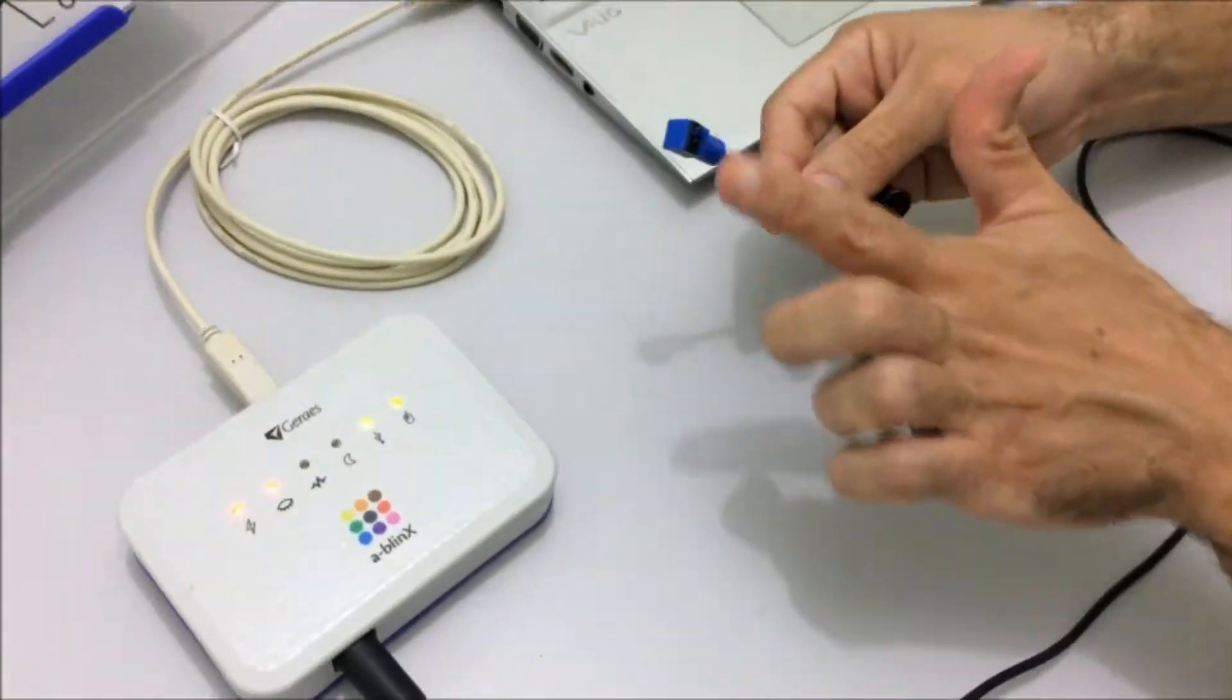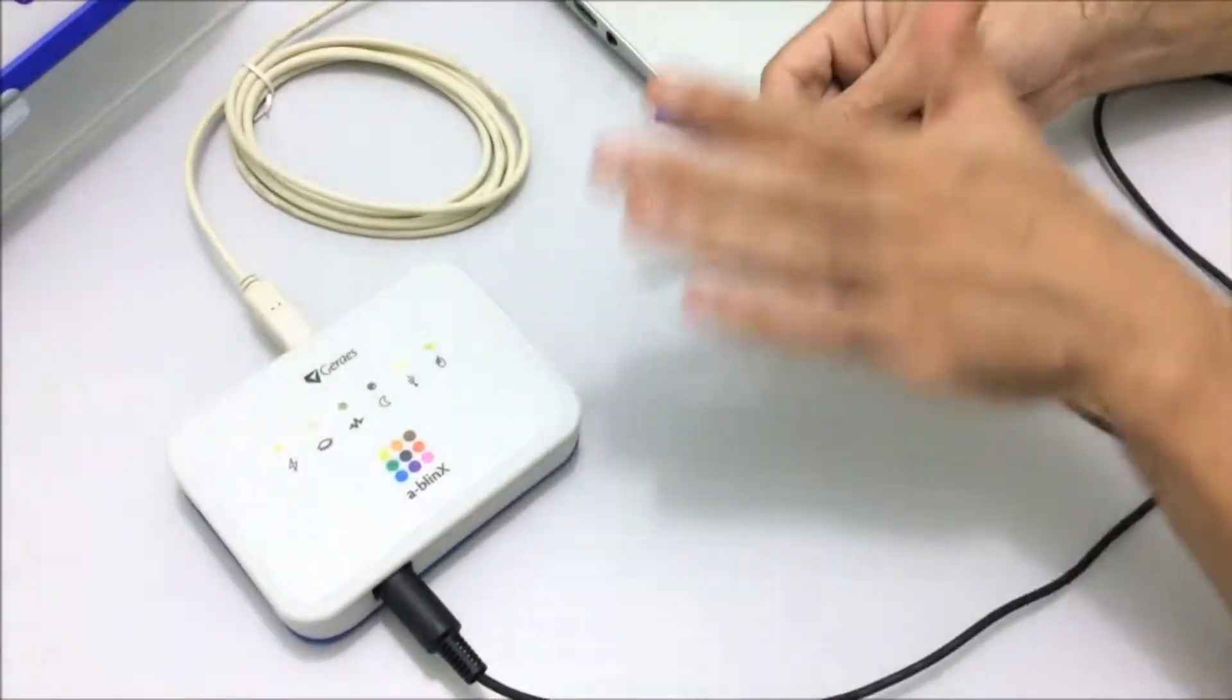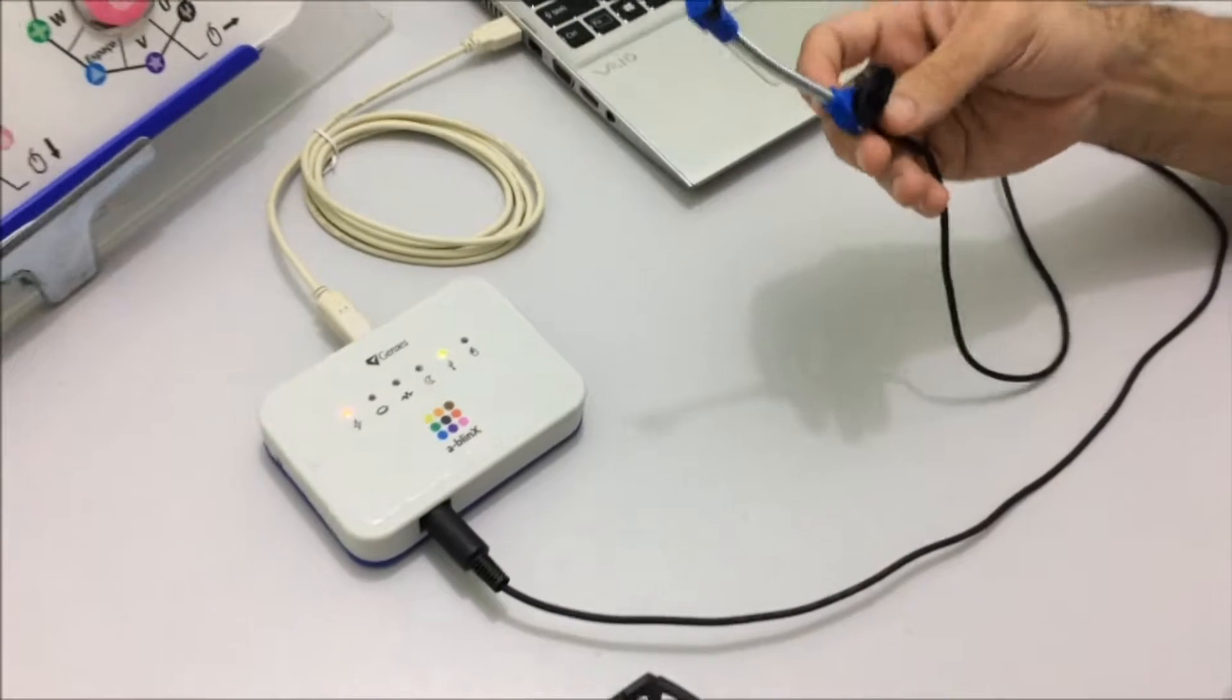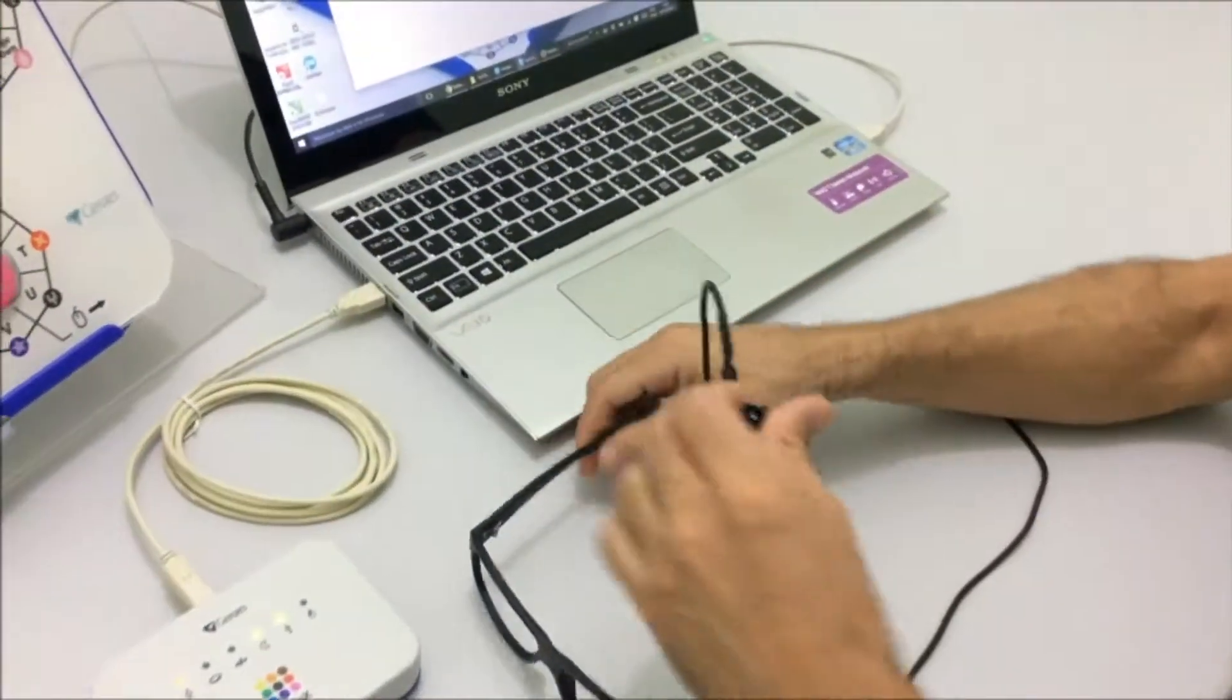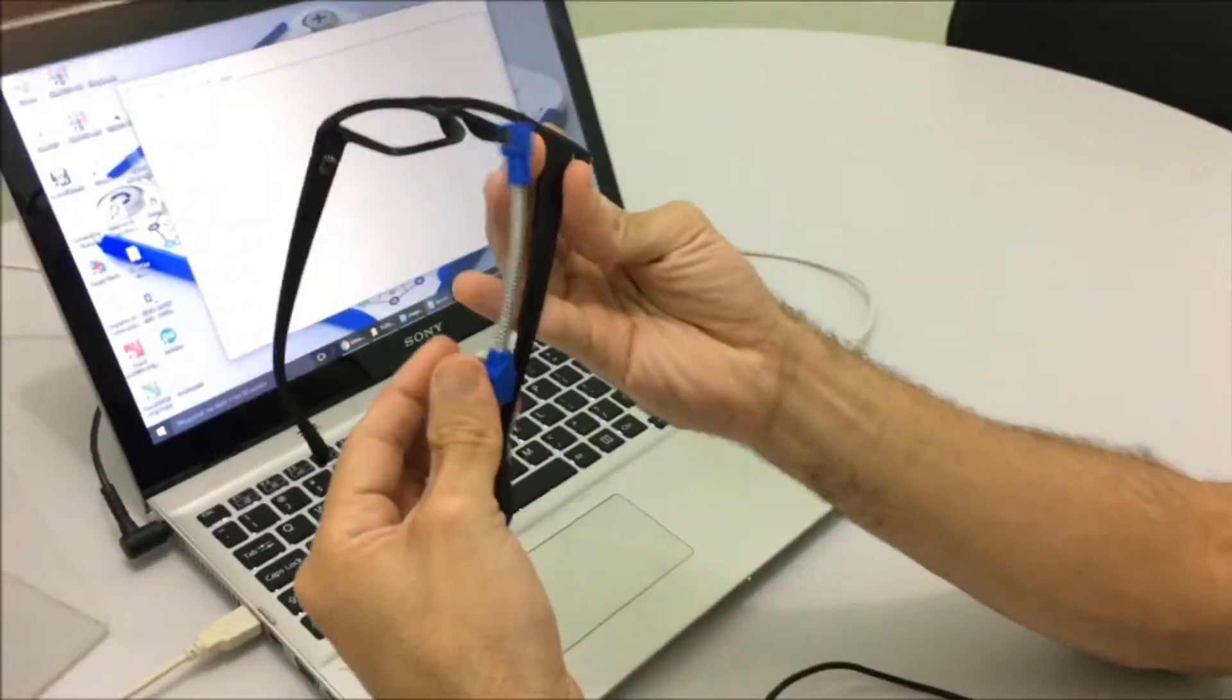Plug it in all the way, and to test if it's working, you can just wave your hand in front of the sensor. You can notice that every time I pass the hand in front of the sensor, it signals it by flashing its lights and beeping. It means that it's able to detect the eye blink.